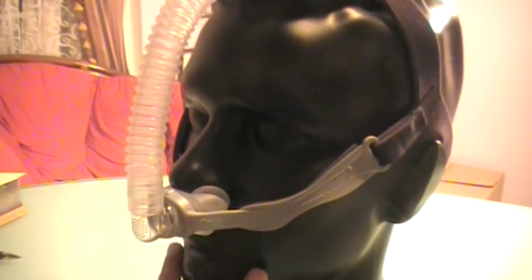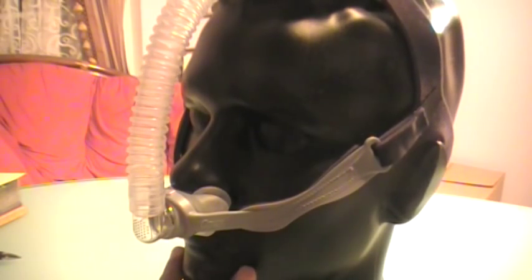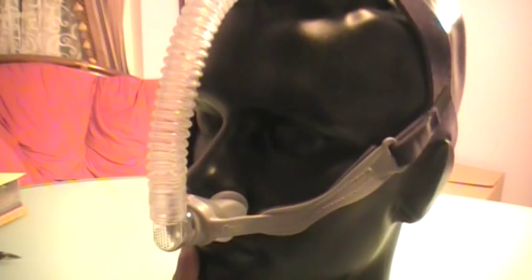The only problem is if you're suffering from allergies during allergy season or just a head cold temporarily, you cannot use this type of mask. You would need to use a full face mask.